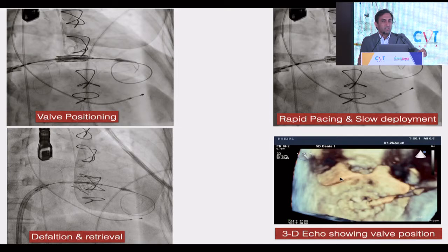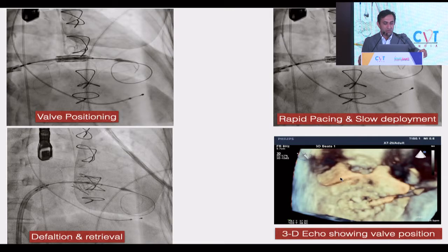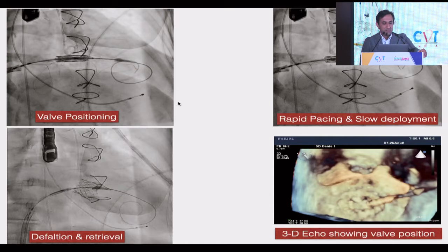We inflate the septum with a 12 or 14mm balloon — here only a 10mm was used. The patient had enlarged RA and RV; we hoped to avoid a right-to-left shunt, but eventually the valve didn't cross, so we ended up doing a bigger balloon dilatation.